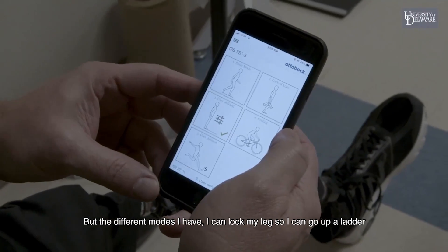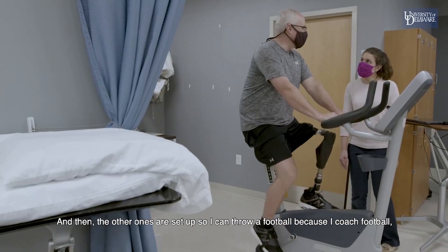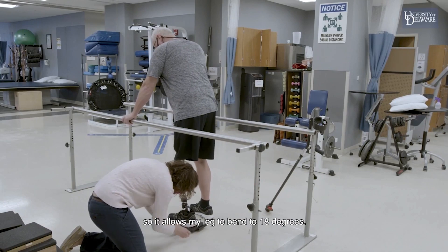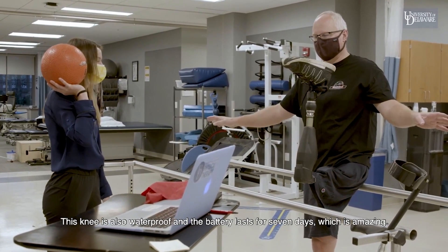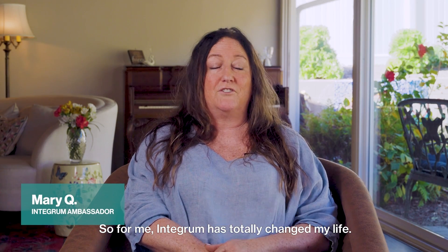I have different modes: I can lock my leg so I can go up a ladder, I have one set up for riding a bicycle, and another set up so I can throw a football because I coach football. It allows my leg to bend to either 18 degrees, or I have one set up for PT up to 40 degrees so I can do squats and exercises. This knee is also waterproof and the battery lasts seven days, which is amazing. Integrum has totally changed my life.